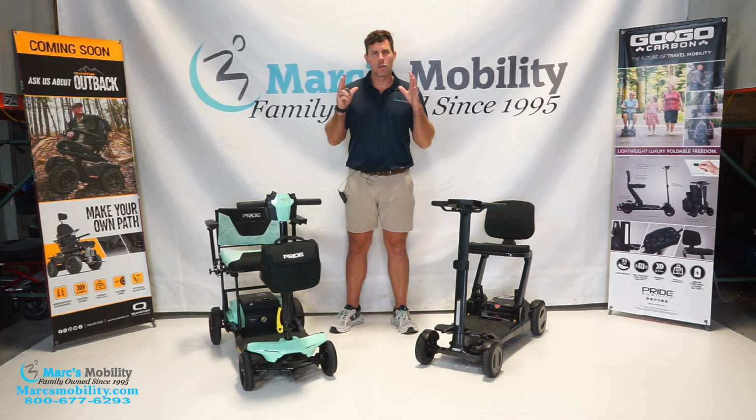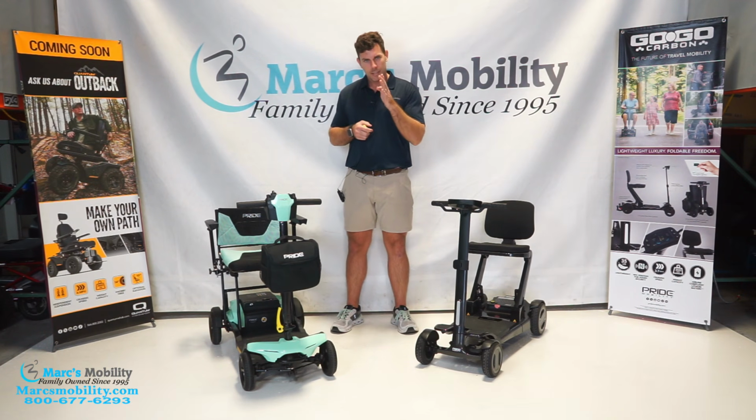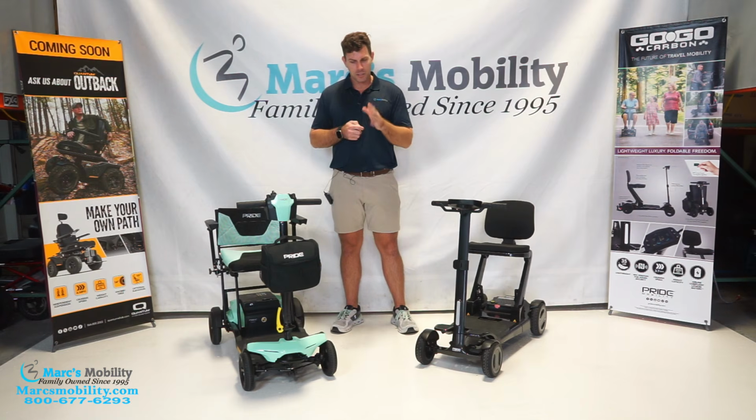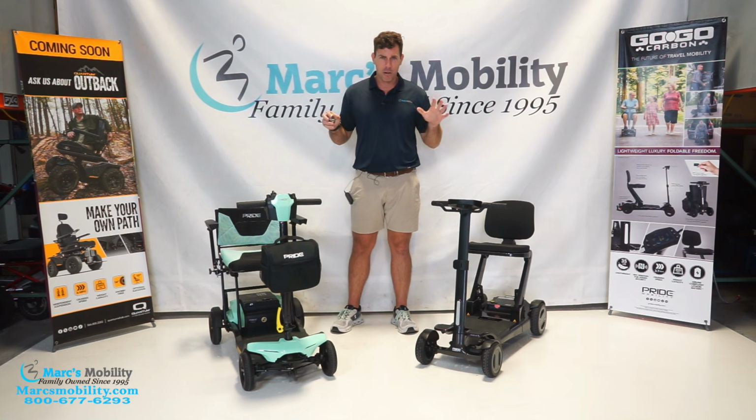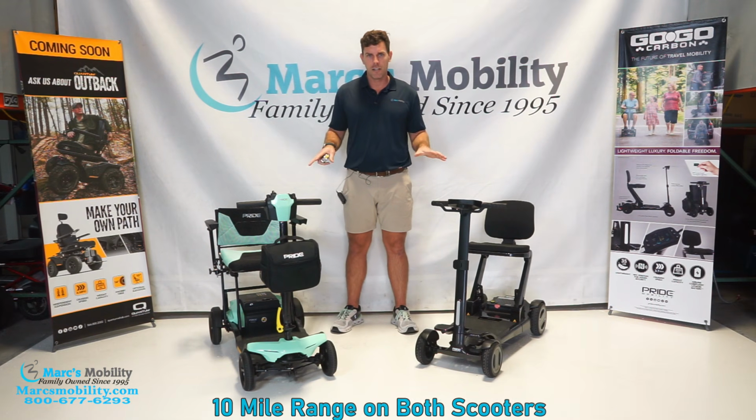The next comparison we're going to go over is going to be overall distance of the units. Once again, this is going to depend on the weight of the user, the slope, and the terrain that you're driving it on, but both of these are approximately going to get up to 10 miles of distance on a full charge.